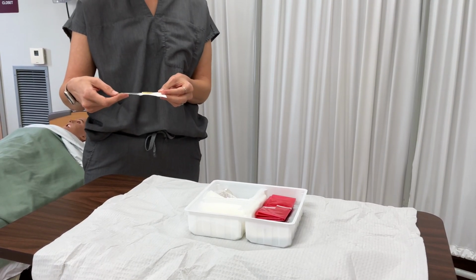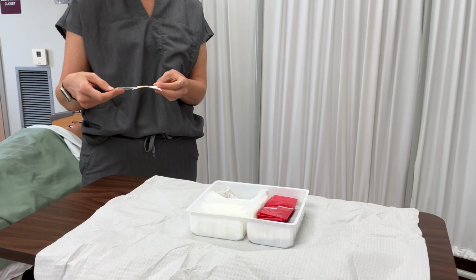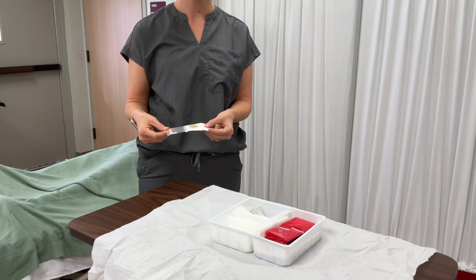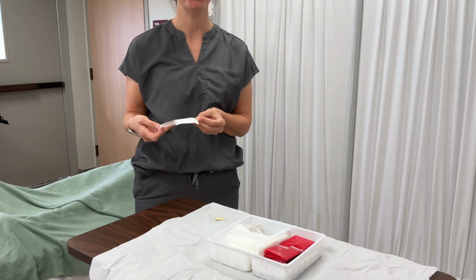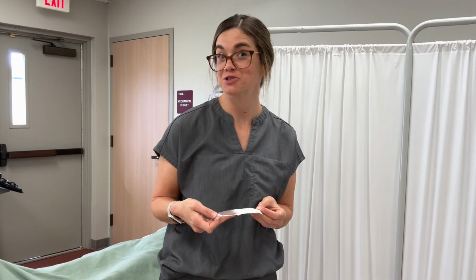If it lands on the 1-inch border or not in the field, it is considered contaminated and you need to toss another one in. All right, I'm going to go ahead and take this and toss it in. 1, 2, 3. Beautiful. We actually had to take this a few times. So if your item does roll off into the trash can like mine did, it's okay. You're just going to get another one.